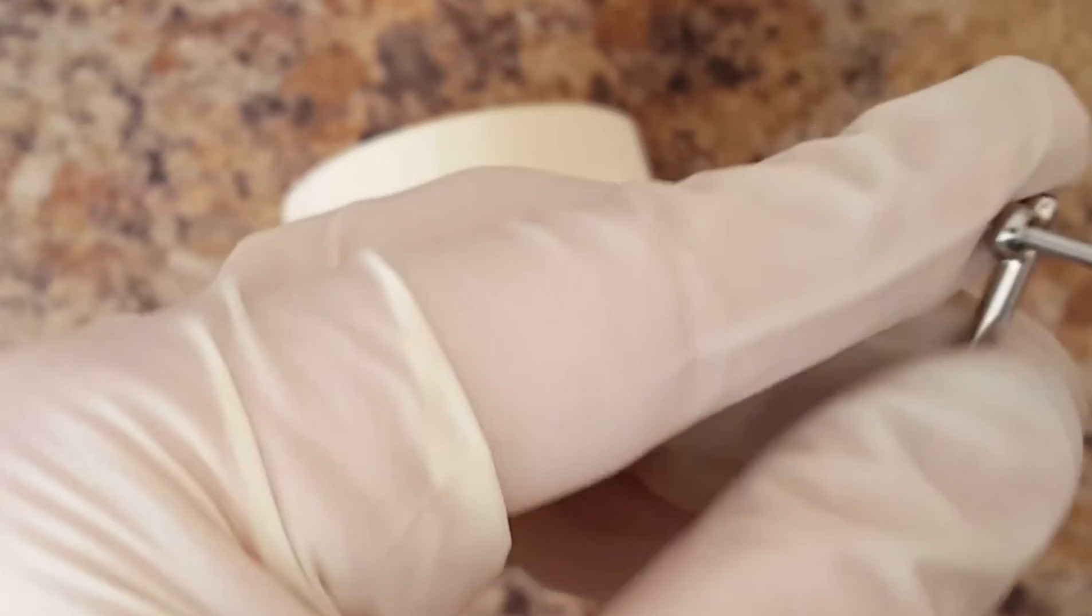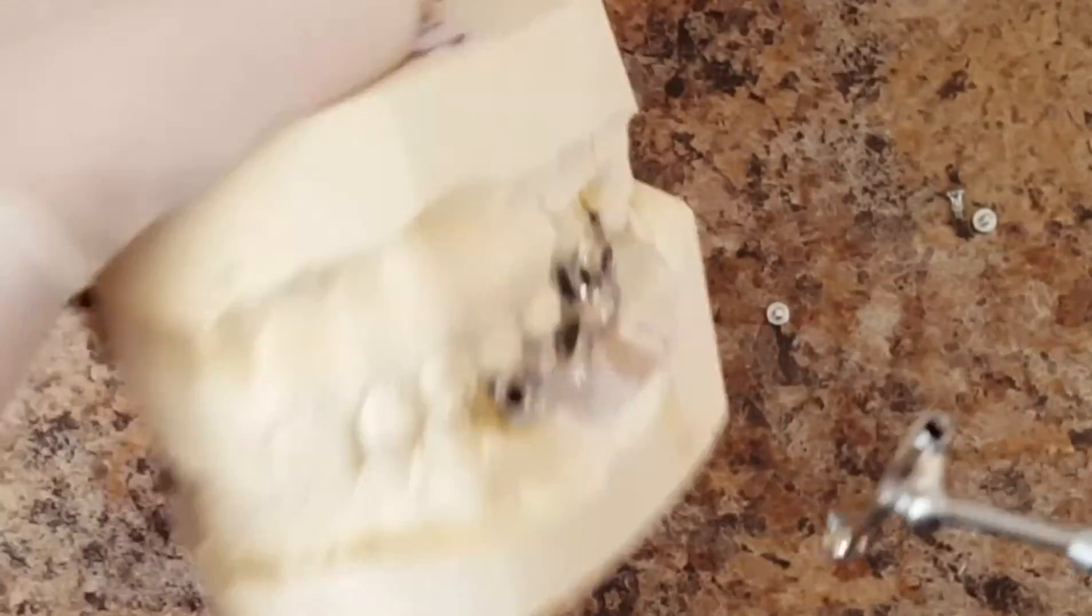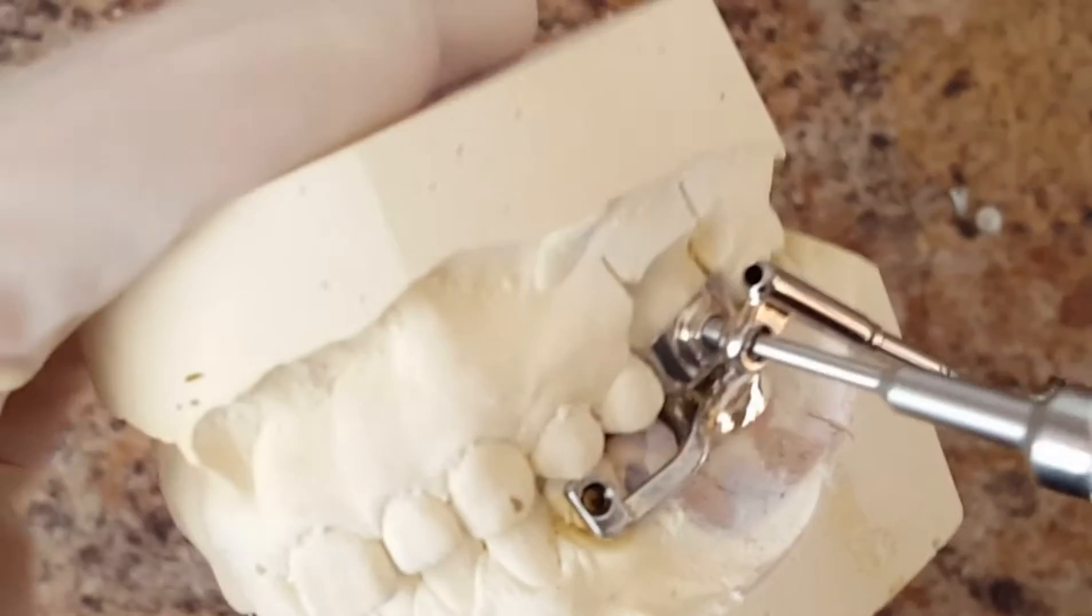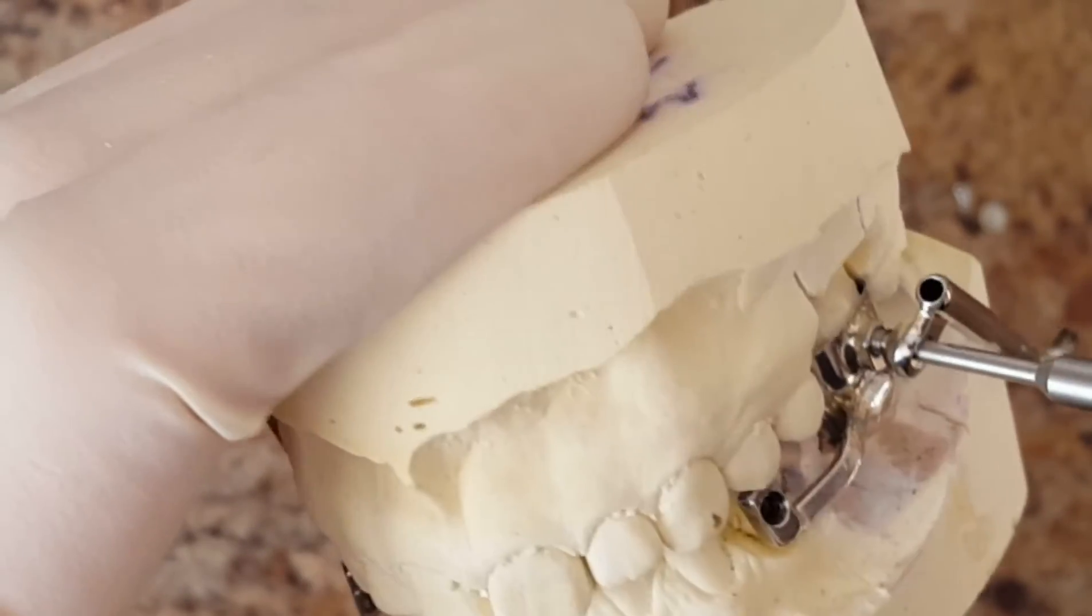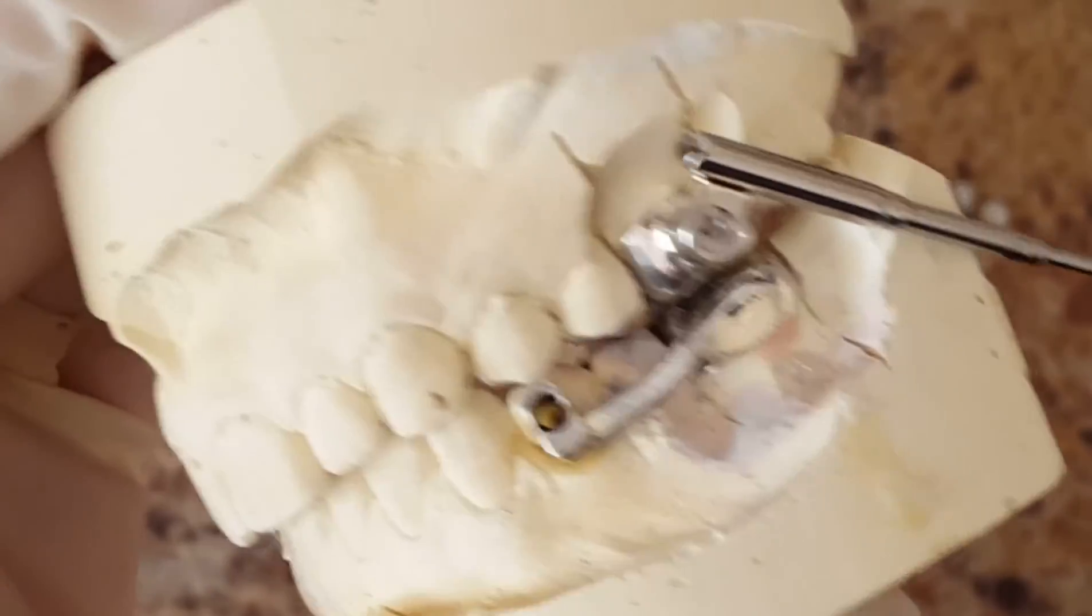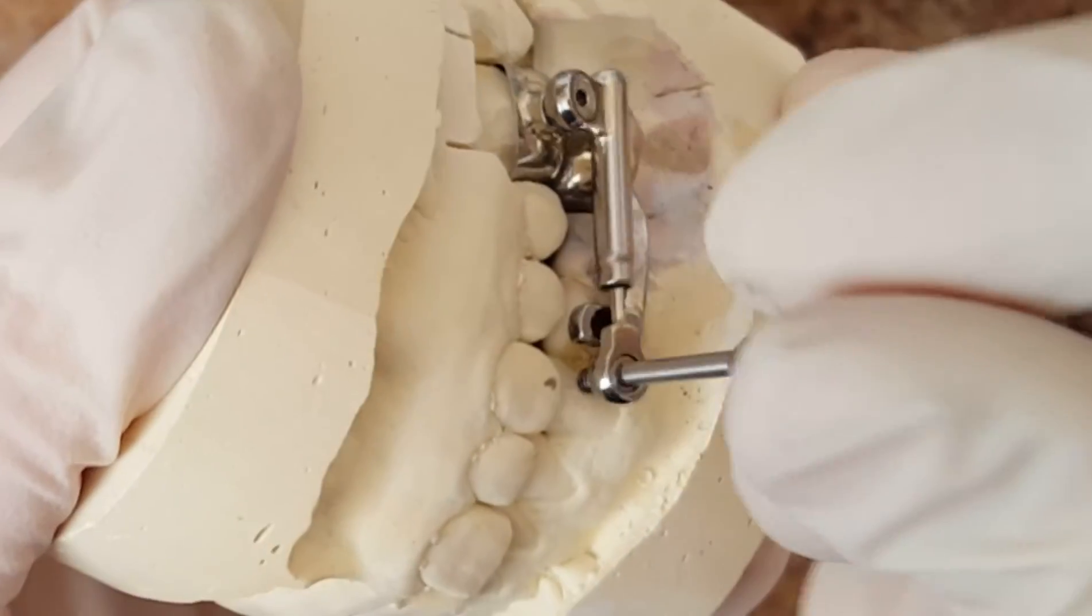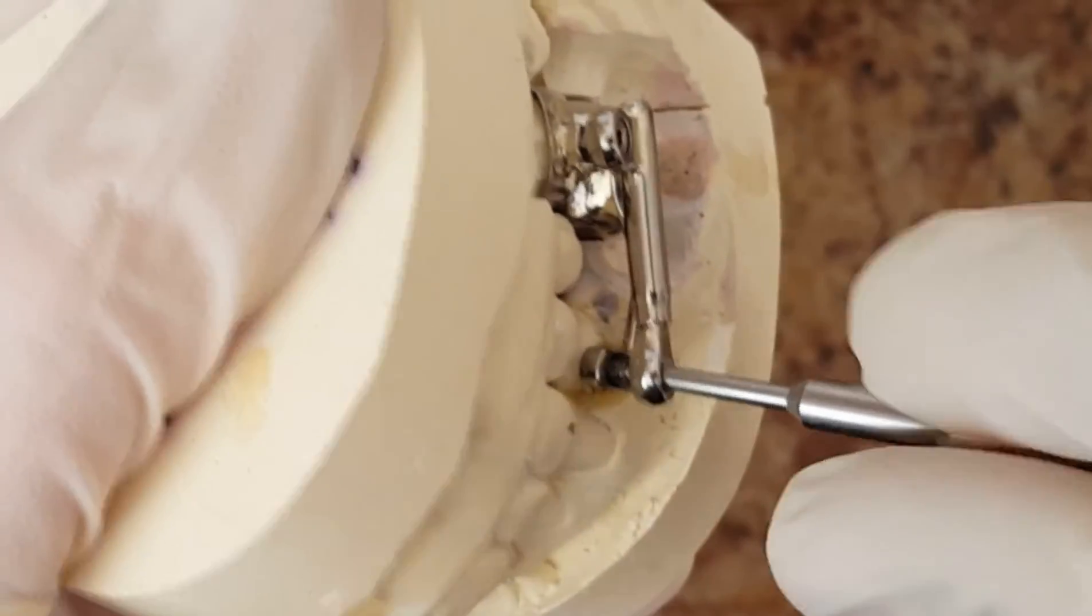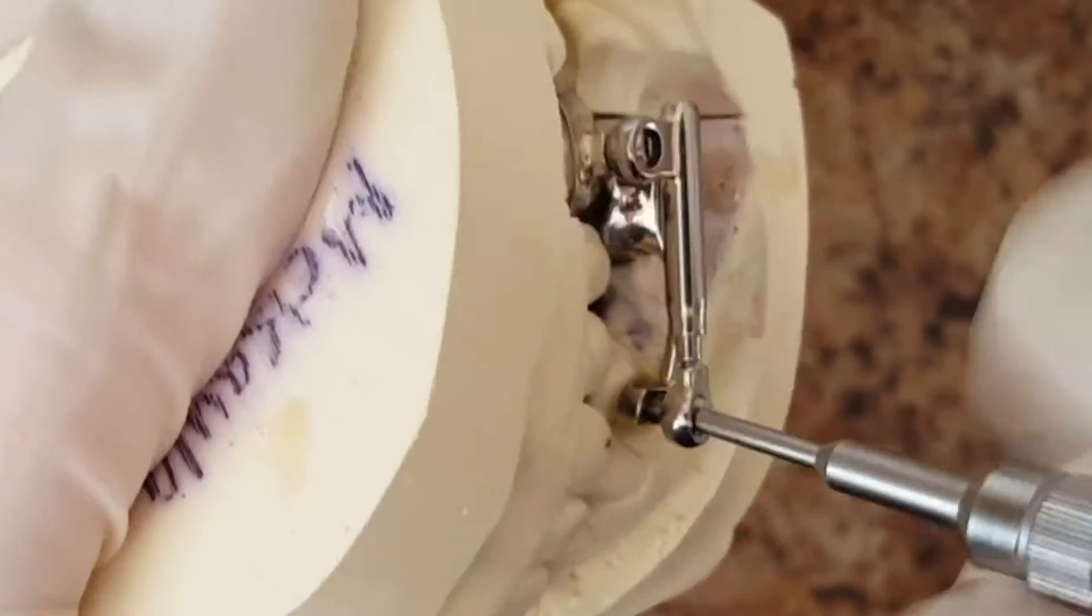This next assembly is the Hanks Telescoping Herbst. The hex head screw is actually incorporated into the arm. It's very easy to use. I like to use an Allen wrench that's a built-in screwdriver for this process. The Hanks also is very functional and has great lateral side-to-side movement.